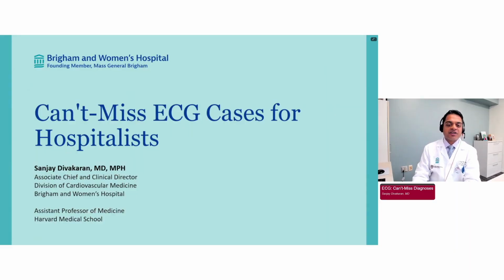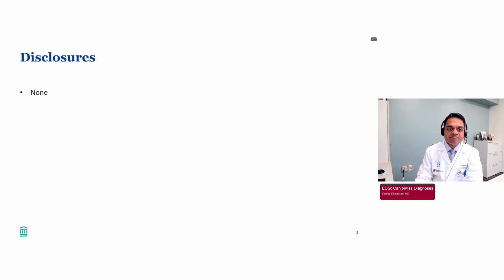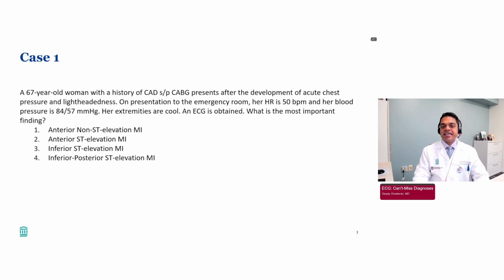Thanks so much, Chris, and thanks everybody for joining this morning. Excited to be here. So I have no disclosures. We're going to go through 15 cases together. They all involve obviously an ECG, and then we'll have an audience response here to work through the cases together. And I will put a plug in for the evaluations. I find the comments incredibly informative to make hopefully the talk better every year.